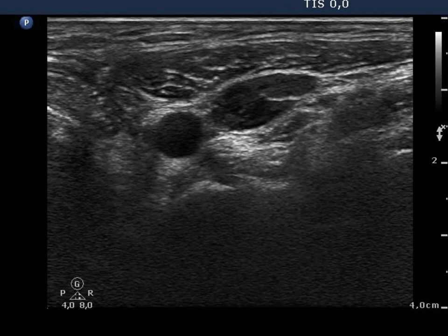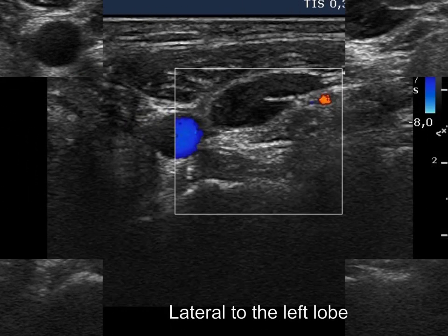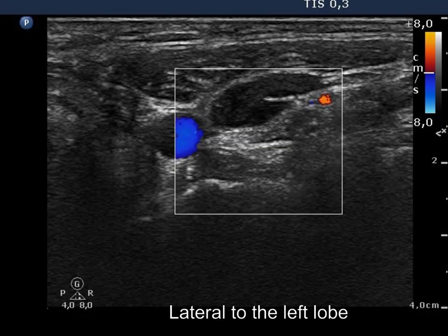There is a reactive type lymph node lateral to the left thyroid bed. The node has a regular hilum and normal vascularity.